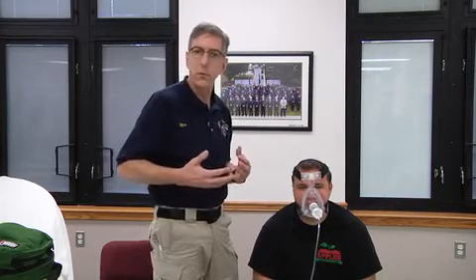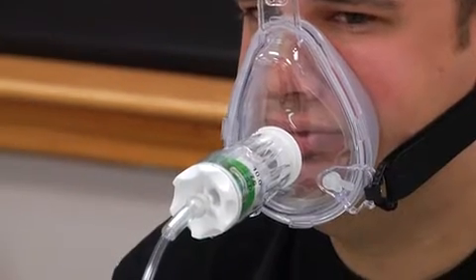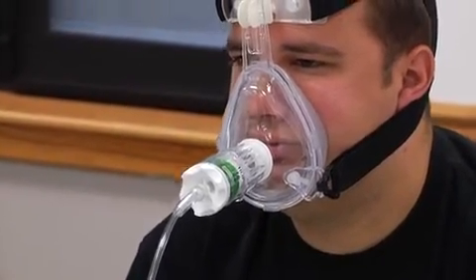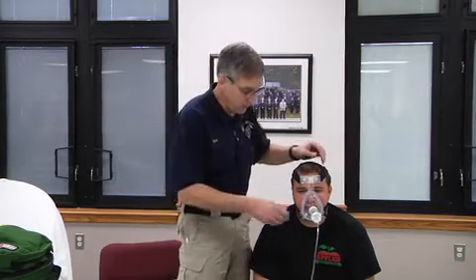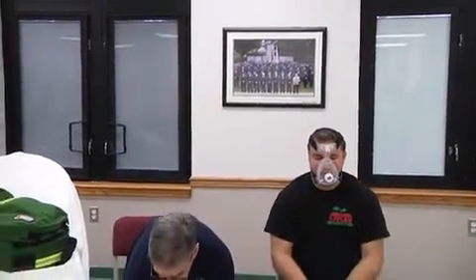Those are all measurements that tell us CPAP is working. After about 20 minutes — which is a reasonable period of time — if those numbers aren't changing in your favor, you may try increasing the pressure over that period. But after 20 minutes, if you've maximized pressure to what the patient can tolerate and you're not getting anywhere, it's time to stop using CPAP and move to some other form of respiratory support.